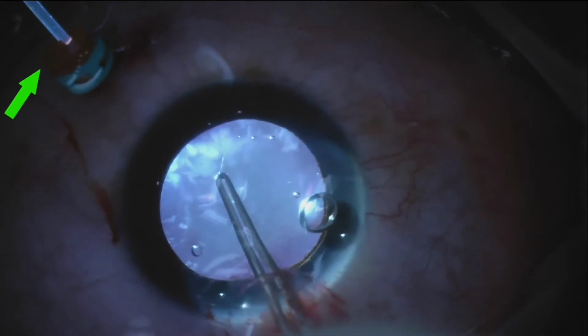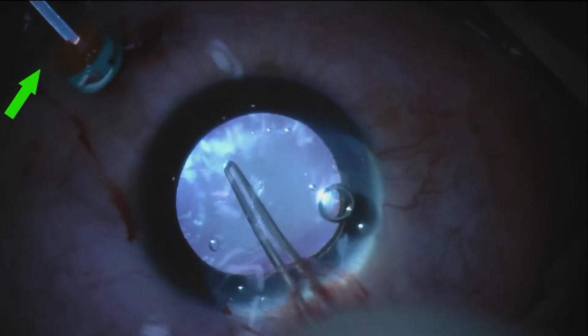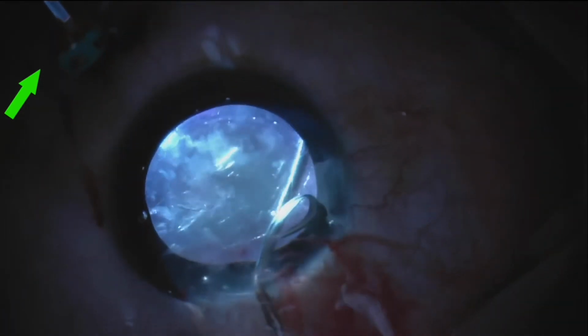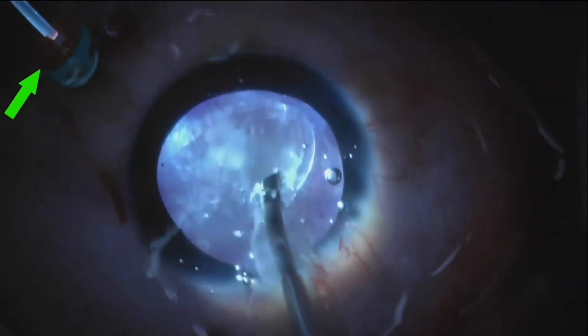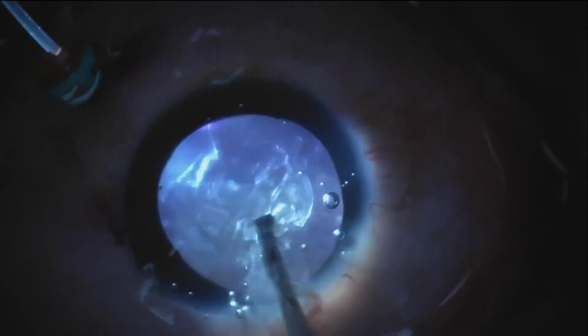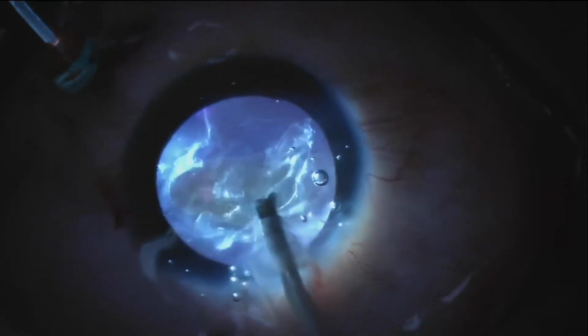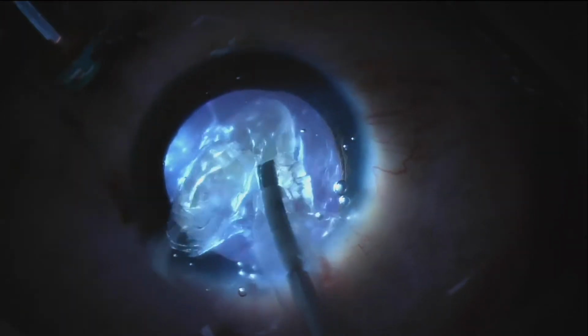Here is a later segment from the same patient's surgery. Note the new position of the chandelier as it is directed horizontally towards the lens. This retroillumination technique provides crisp detail of the lens structures and provides optimal visualization during nuclear and cortical removal.